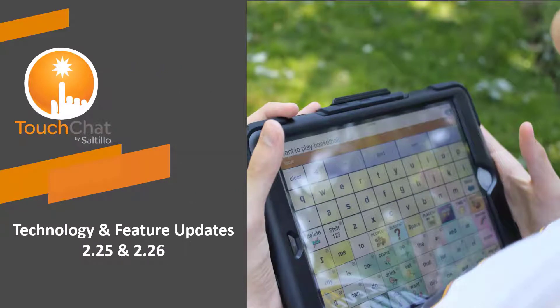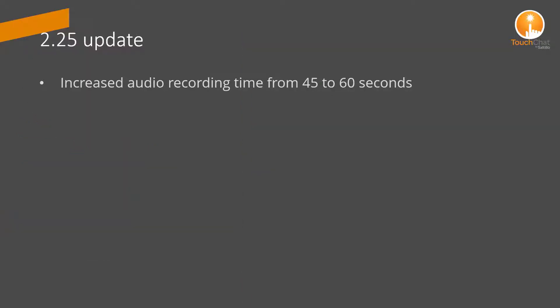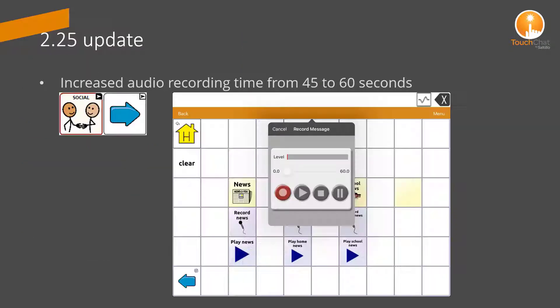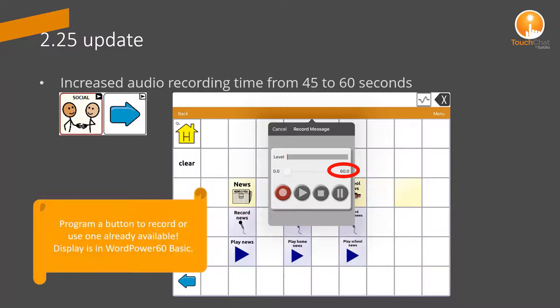Let's explore new features with the 2.25 and 2.26 update. In the 2.25 update, the audio recording time limit was increased from 45 to 60 seconds. You can program a button to record or use one found in the vocabulary.